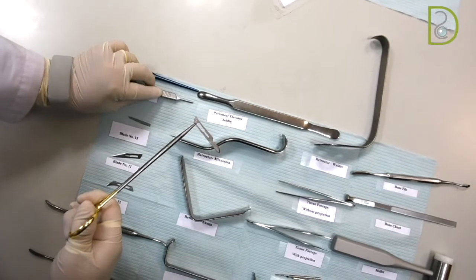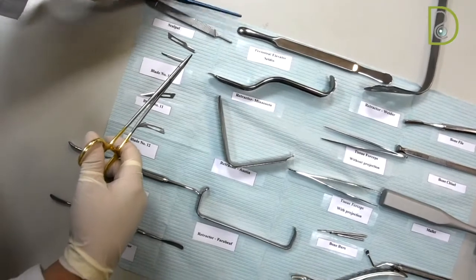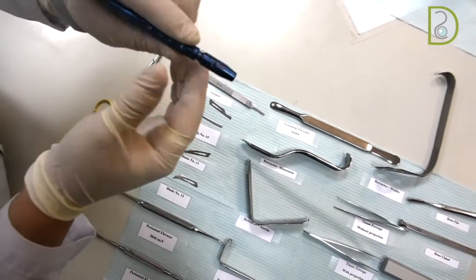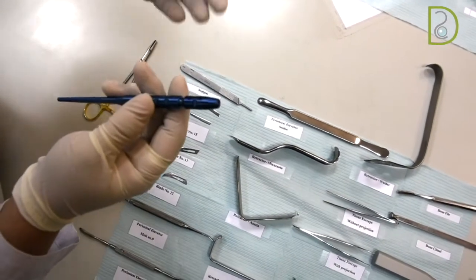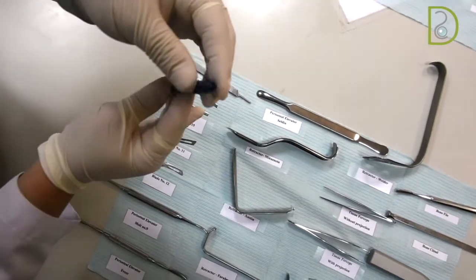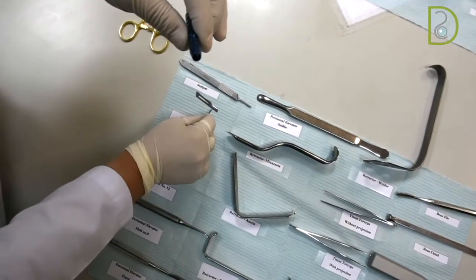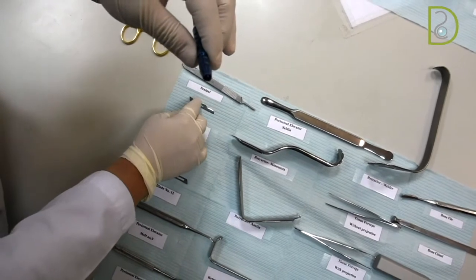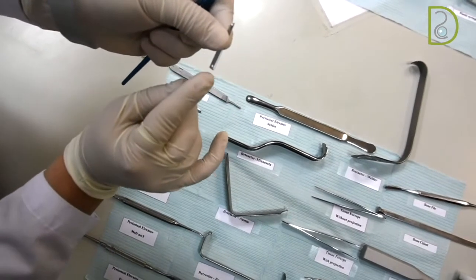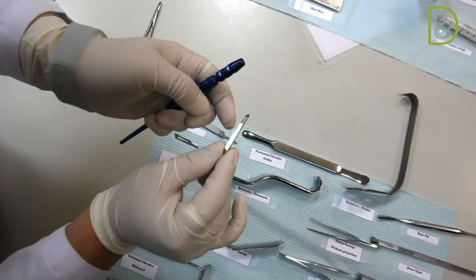There is another kind of blade holder. We call it the microblade holder, and it is for delicate surgeries, mainly the periosurgeries. They are for gingival grafts or connective tissue grafts. This unique design is to hold the small blades that are usually the same as the blades in the regular or the universal shape. And as you can see, it doesn't have the sleeve design that you could have seen on the previous design.